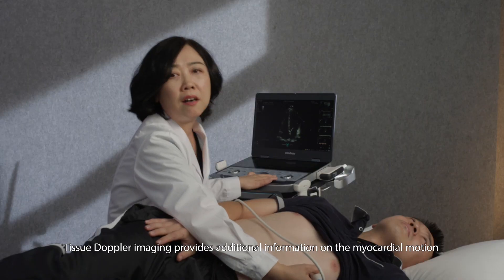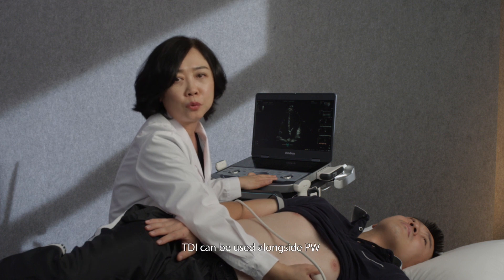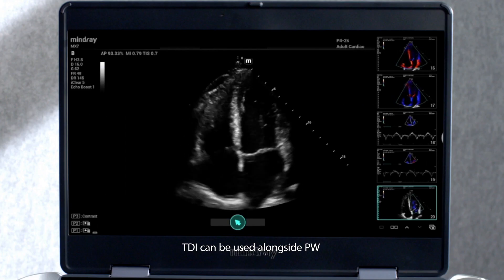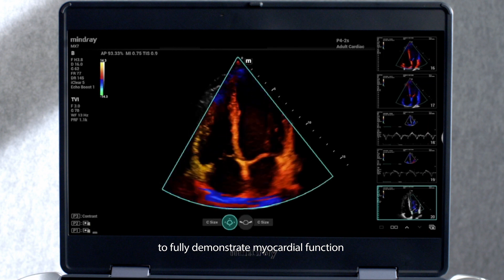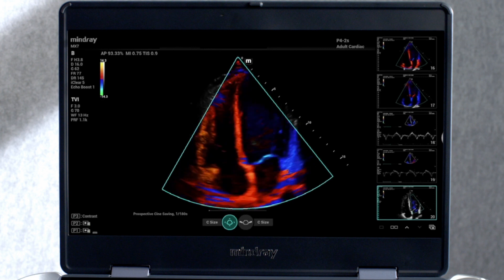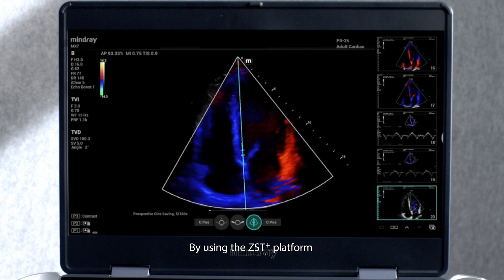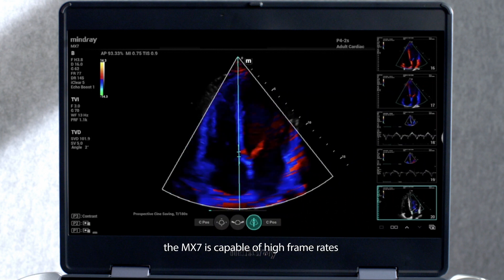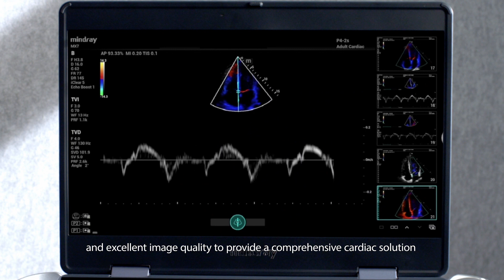Tissue Doppler imaging provides additional information on myocardial motion. TDI can be used alongside PW to fully demonstrate myocardial function. By using the ZST platform, the MX-7 is capable of high frame rates and excellent image quality to provide a comprehensive cardiac solution.